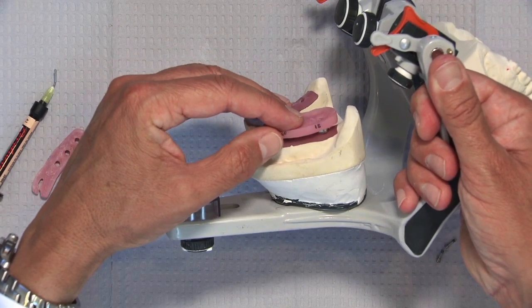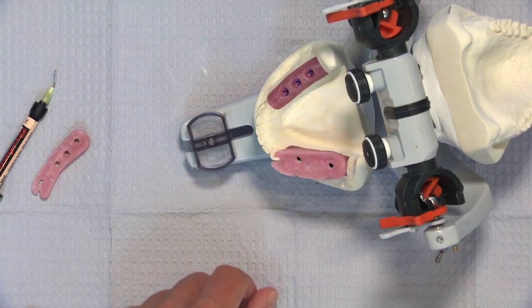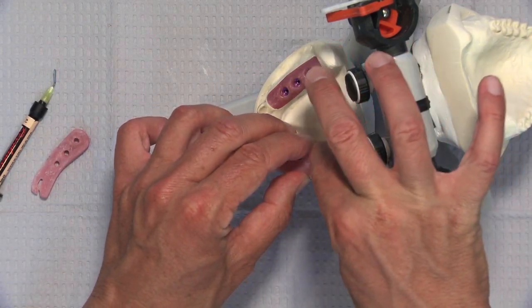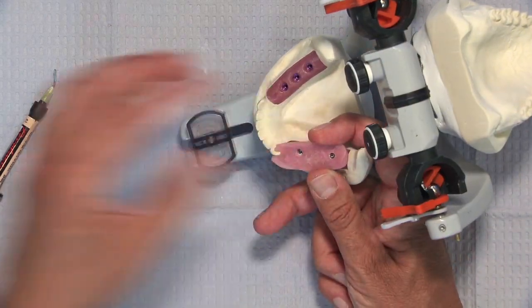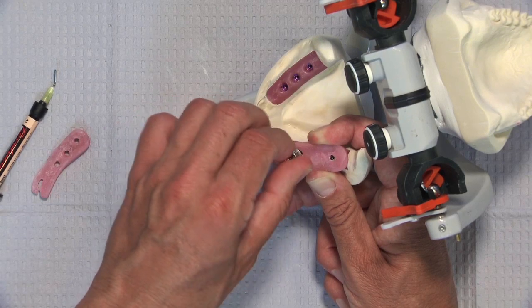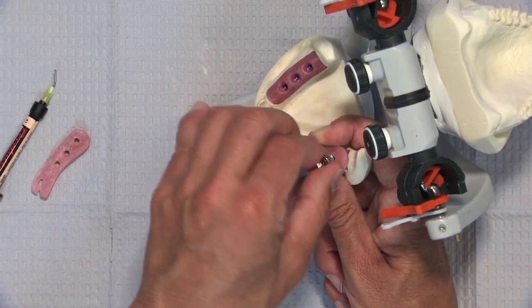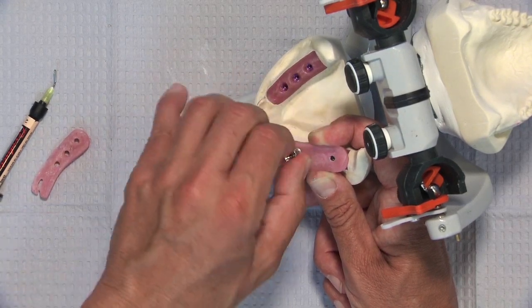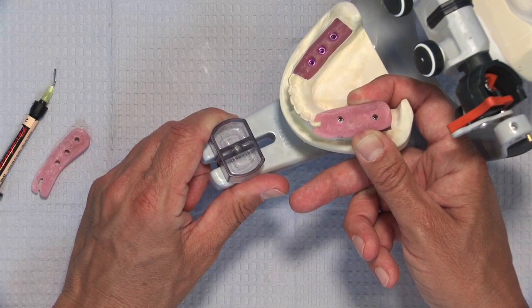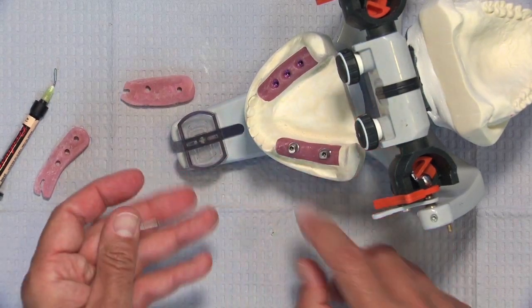Now we'll take the index, and not only should the two custom abutments fit into the soft tissue spots, but you can see when viewed from the occlusal that it also has an index on the adjacent natural tooth. At this point, we'll drop the two screws into the custom abutments and then begin to tighten the screws down. I can feel the distal part of the positioning index seating as the screws tighten down as it falls into place. Again, with the custom abutments being held so that they really can't rotate. Just going back and forth and making sure that they are tight. Then I verify occlusally that we're in good solid contact with the cuspid in this case. At this point I can take my little index off and just flick off the two little pieces of flowable composite that kept it from falling out of the splint.